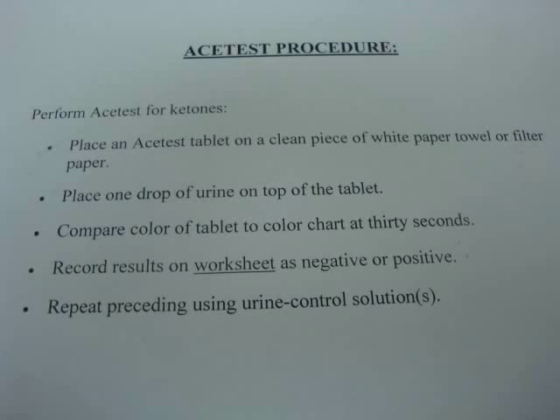The procedure for doing an Acetest is — let's look at our directions so we know what to do. This procedure must be followed exactly. Number one: remove the tablet from the bottle and recap promptly. Place the tablet on a clean dry white paper. Put one drop of urine directly on top of the tablet. Compare the color of the tablet to the color chart at 30 seconds after application of the specimen. Results are recorded as negative if no purple color is apparent on the tablet at the appropriate reading time. Positive results are recorded as small, moderate, or large on comparison with the color chart.